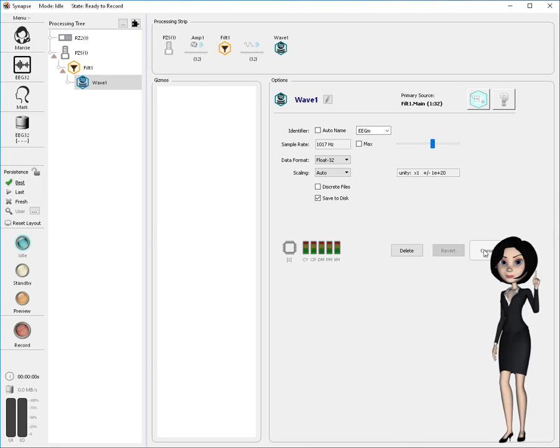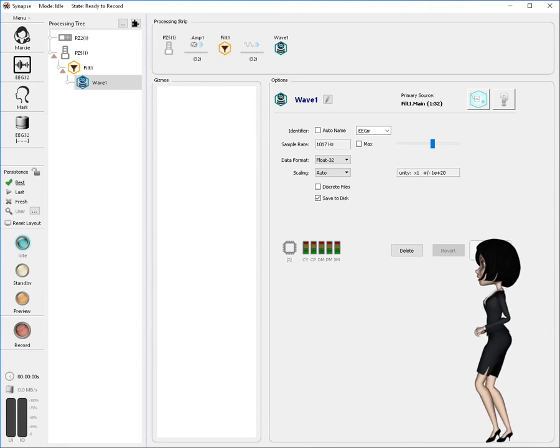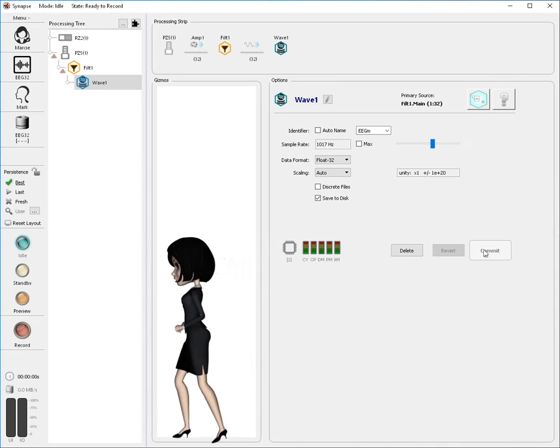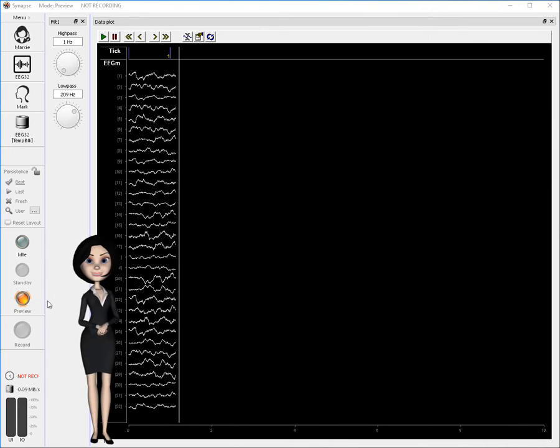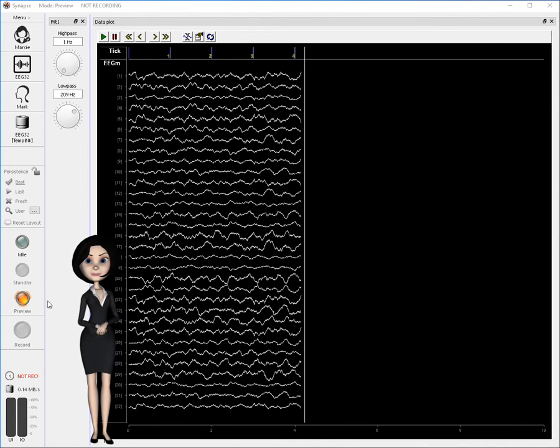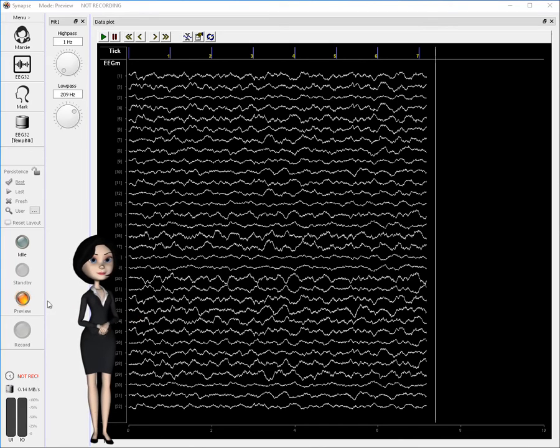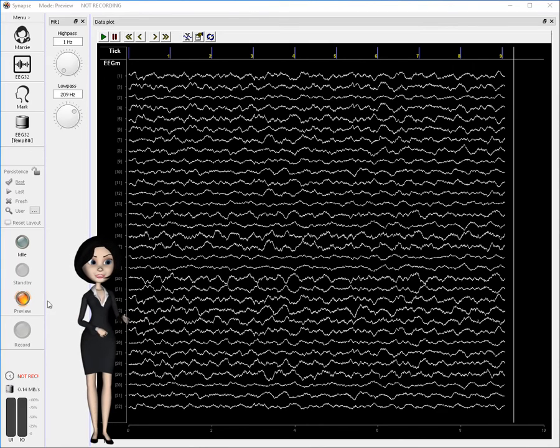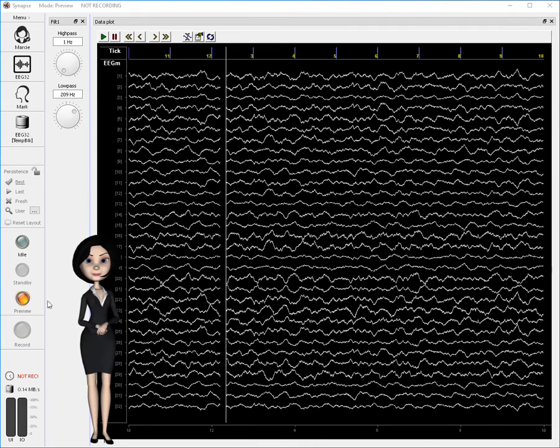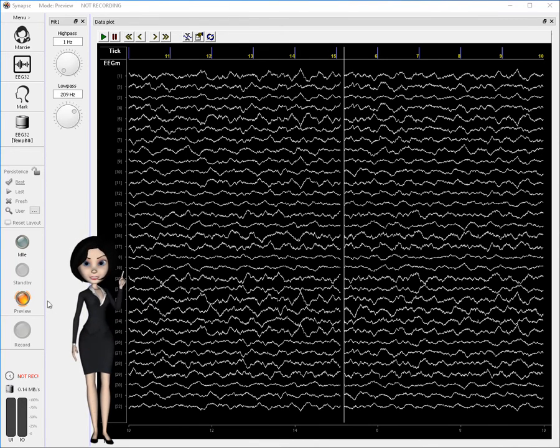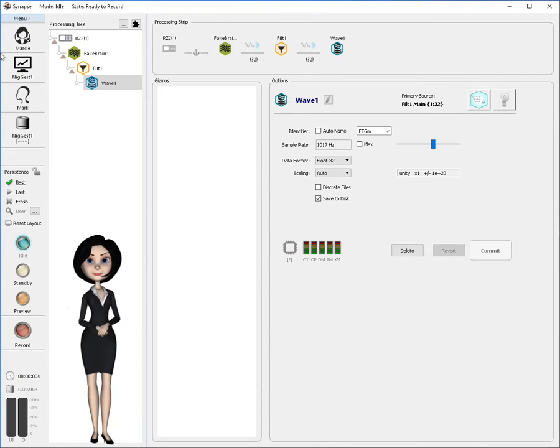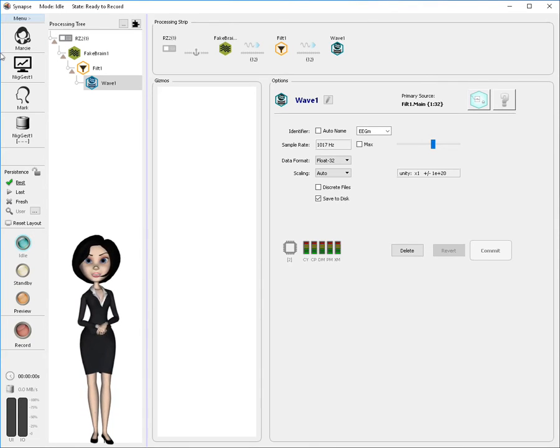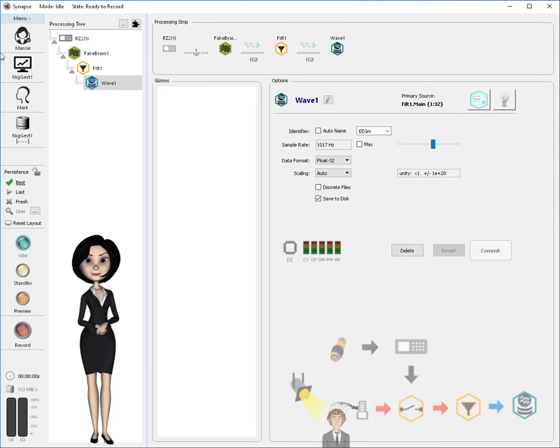Remember, we still must add our artifact rejection gizmo. But just for fun, let's take a look at some data recorded from what we have currently. As you can see, by simply clicking the preview button, we can begin to look at the results of our experiment. To be fair, the traces you see here are generated using a fake brain. Mark's actual EEGs would be far less interesting. By clicking idle, we go back into idle or edit mode. Note that I've replaced the PZ5 as the source of EEG signals with a fake brain gizmo. This relieves me from having to deal with an uncooperative Mark.